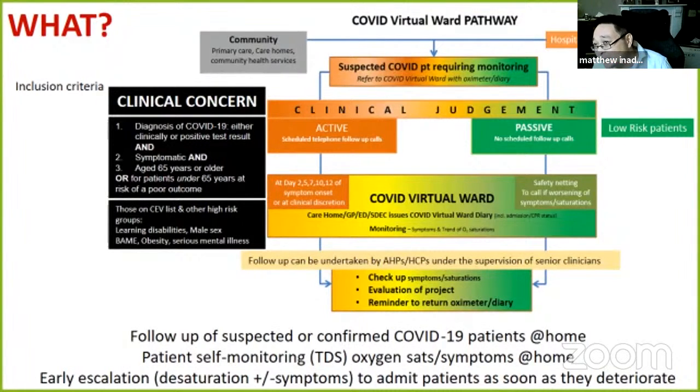So if we are used to abnormal and being shown abnormal, we don't take the seriousness of a minor deflection of oxygen levels as much as we potentially should. It does make me reflect on the cases I've seen, and the fact that a very small deflection of oxygen saturations is incredibly significant if you normally run normal.